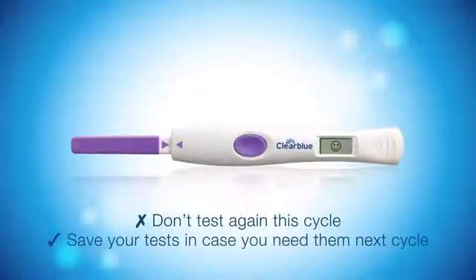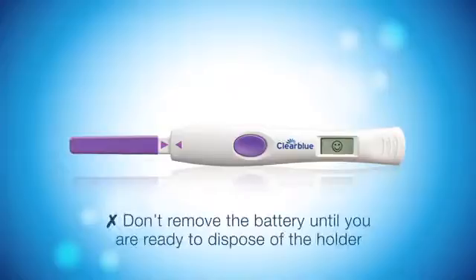You can save your tests. Don't remove the battery until you are ready to dispose of the holder. If you do, it will break the holder and you won't be able to use it again.